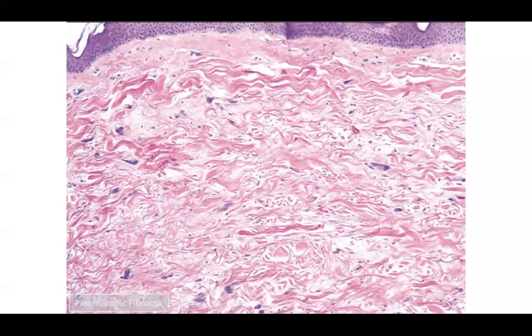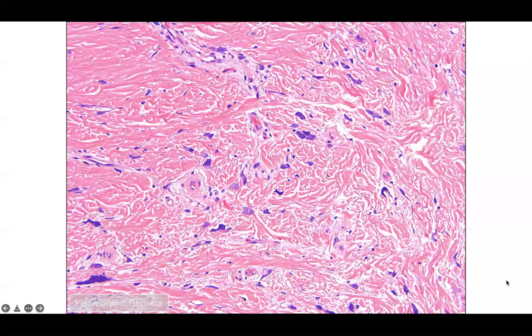Normally, dermatofibromas or other variants are not going to have CD34 positive cells, so that makes this entity pretty special because you have the cellular pleomorphism scattered and you've got the CD34 positive cells. Another really good example of a pleomorphic fibroma. Again, I've seen many examples of these in real life, and they do look exactly like this.